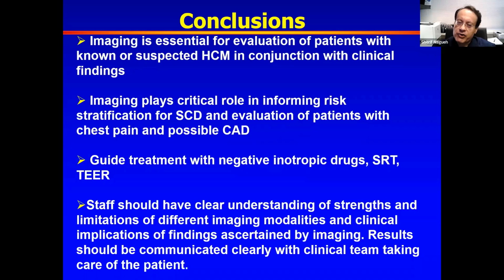When I think of age, I think of a functional age as opposed to an absolute age. In our practice, we've seen patients referred in their 70s who are very functional to the extent that when you look at their exercise performance, it may be better than other younger patients. So if somebody is older and I am following them up either with mild symptoms or questionable symptoms, I have a low threshold for obtaining the echocardiogram.